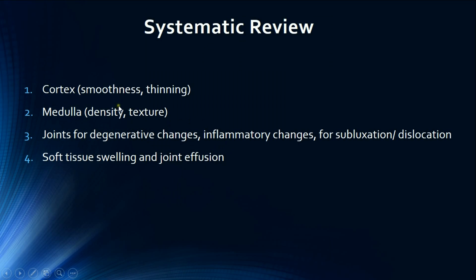Moving to the systematic review of the radiograph, we look at the following: first, we assess the cortex for smoothness and any thinning, as thinning can be seen in osteopenia. Then we look at the medulla for density and texture, which can be affected in various bone conditions. Then we look at the joint for any degenerative changes as in osteoarthritis, inflammatory changes as in rheumatoid arthritis, and any subluxation or dislocations. Finally, we look at the soft tissues for any swelling or joint effusion, both of which can indicate inflammation or bleeding.